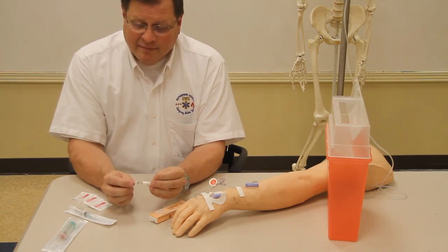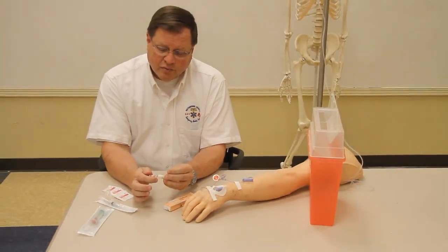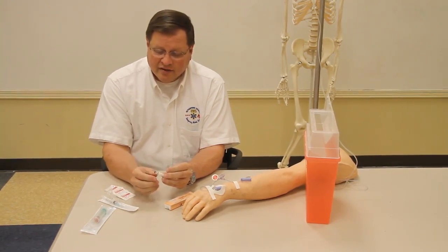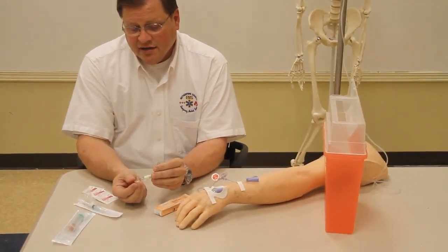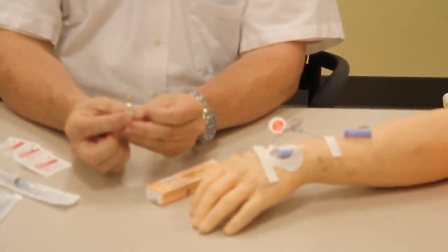When you talk about ampules, they are basically scored at the neck of the ampule right here, okay? And then what you want to do is you want to click that scored piece and make sure that you get all the medication drawn up in the vial. But you can see that we have medication in the neck of the vial, and when I turn it over, the medication still stays there.